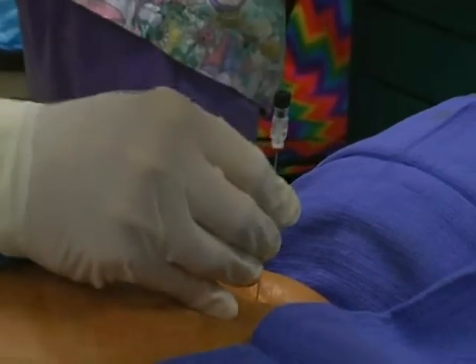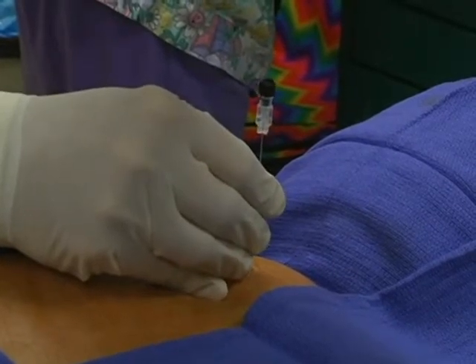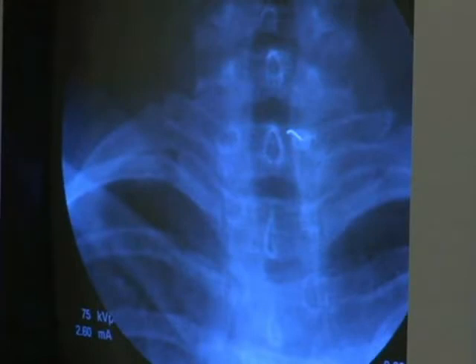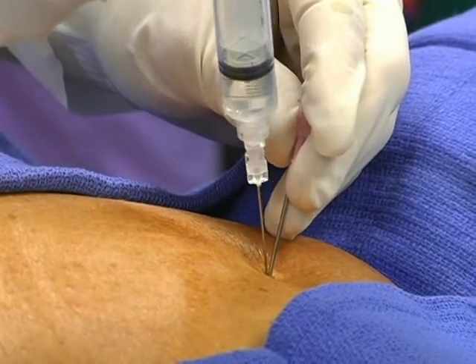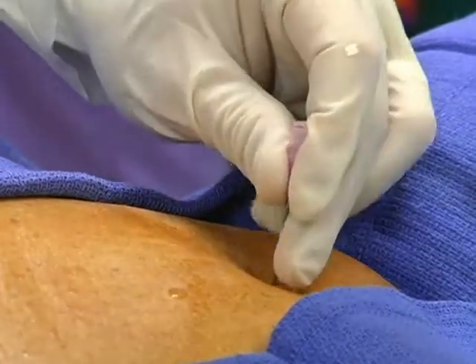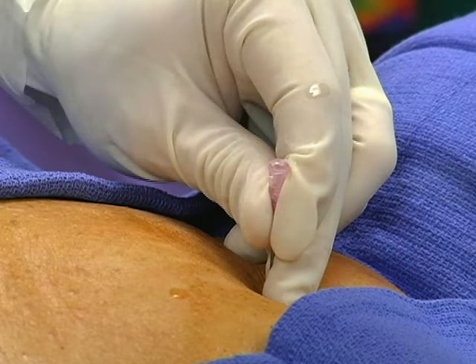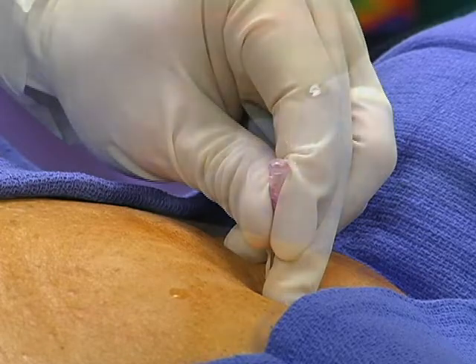Under fluoroscopic control, insert and advance a 22-gauge 3.5-inch spinal needle in a vertical fashion until contact is made with the upper edge of the T1 lamina, 1 to 2 millimeters lateral to the midline. Anesthetize the lamina with 1 to 2 milliliters of 1% preservative-free lidocaine without epinephrine. Anesthetize the soft tissues with 2 milliliters of 1% preservative-free lidocaine without epinephrine as the spinal needle is withdrawn.